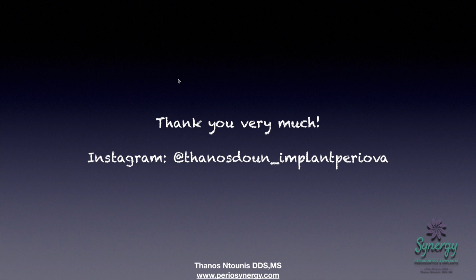Yes, the restoration could have been changed. The implant most likely would have stayed. If it was your implant, I think you would have agreed to keep that implant, although I think we all agree it wasn't ideally placed and the site preparation wasn't ideal either. And the third thing is changing the restorative design, either by reshaping the existing restoration or by completely removing and replacing it.